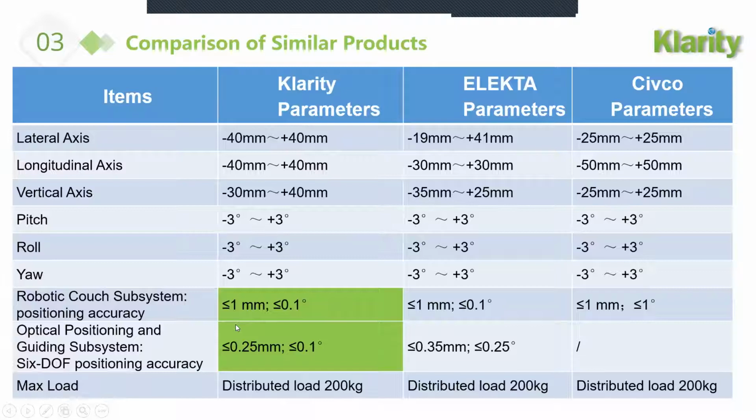And about the optical positioning and guiding subsystem, we have an accuracy of 0.25 millimeter and also 0.1 degree. And the max load is about 200 kilograms.